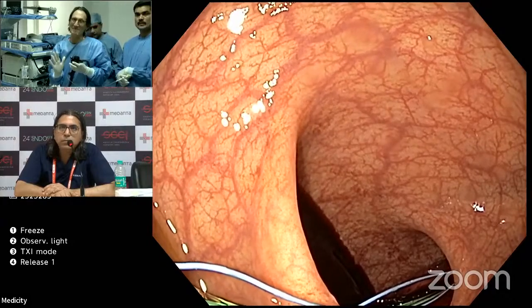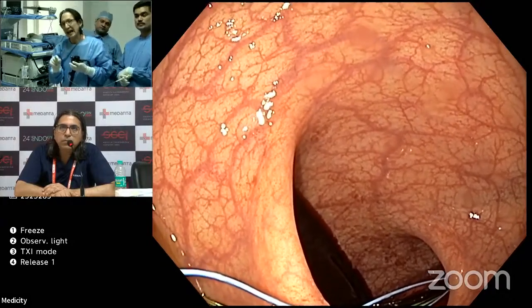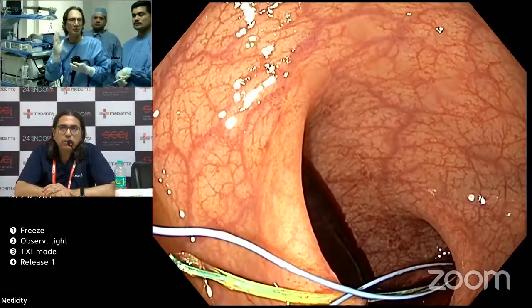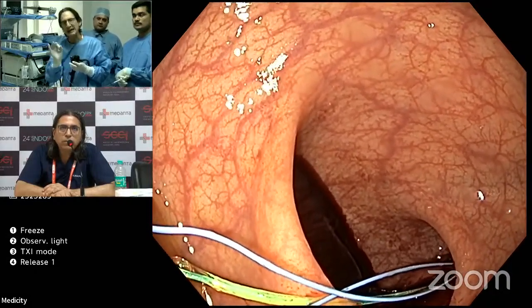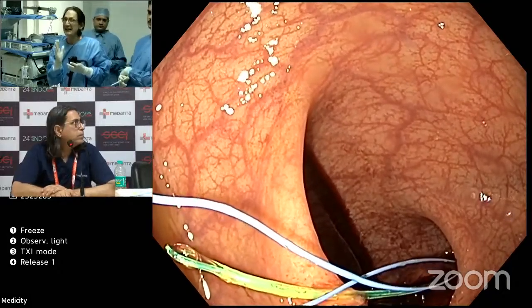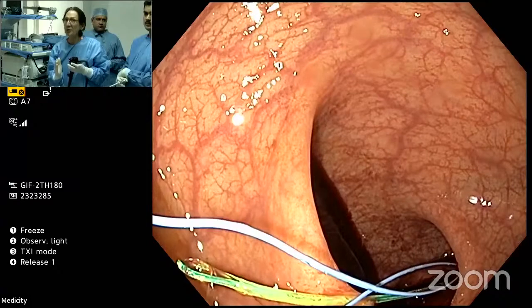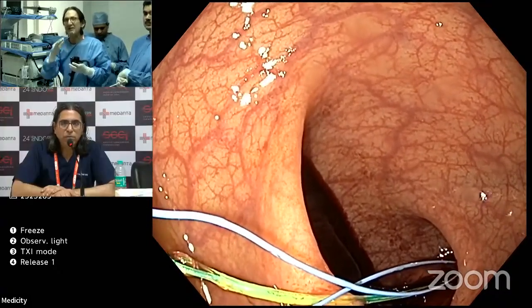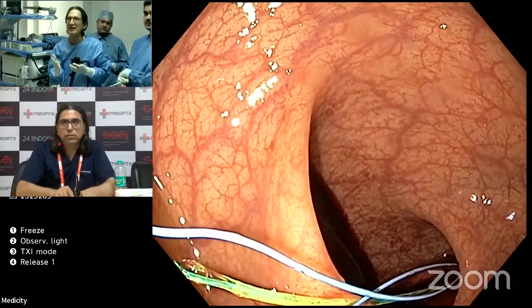So it's really hard to do a STER procedure in the colon. So then you're really looking at just doing ESD otherwise. This would be for if you wanted to resect the lesion completely in the index session. And you have to basically expect that you'll have perforation and you're going to need to close that hole very fast. And that can have disastrous consequences in the colon.